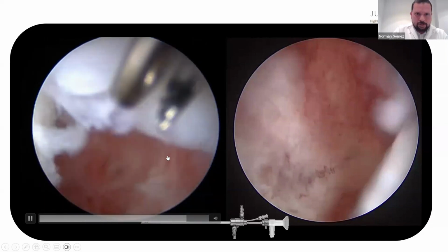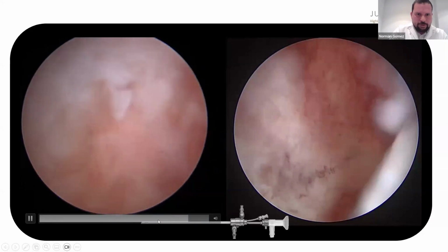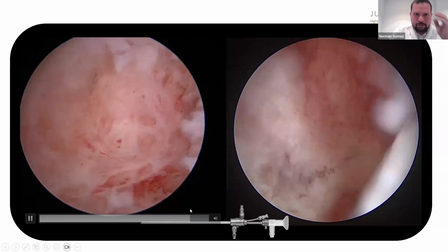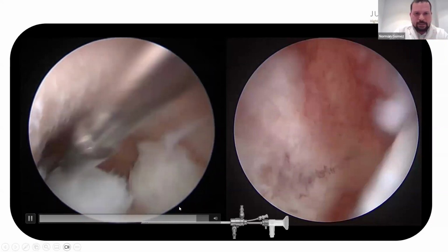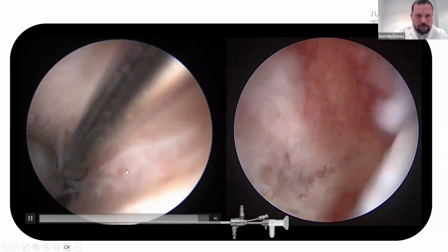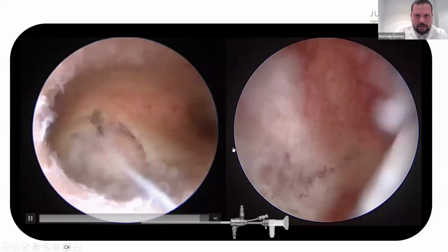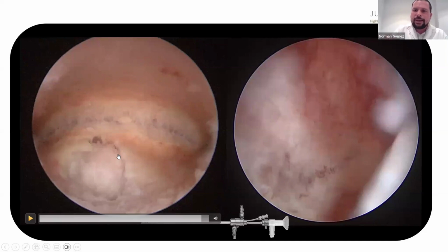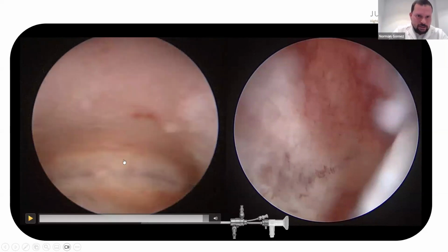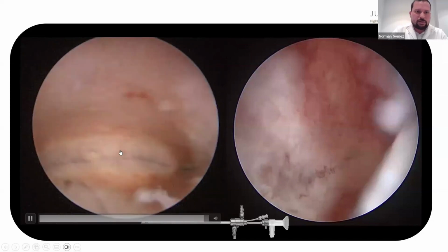So we have two fibroids here. You can see the pseudocapsular plane. This patient has another problem, a thick lateral wall. So normally, to accelerate the process, I reintroduce the fibroid inside the pseudocapsule to gain space inside the uterine cavity to continue working inside the uterine cavity. And in this particular case, I cut the laterals and also the fundus.